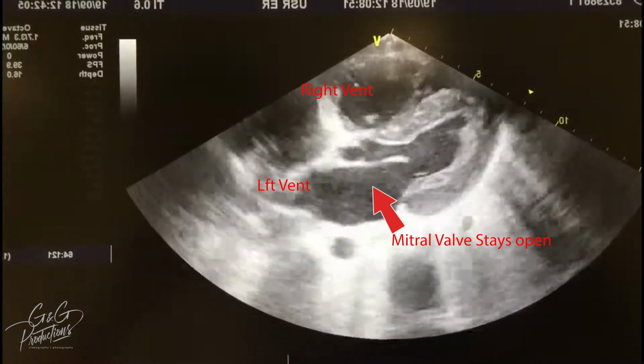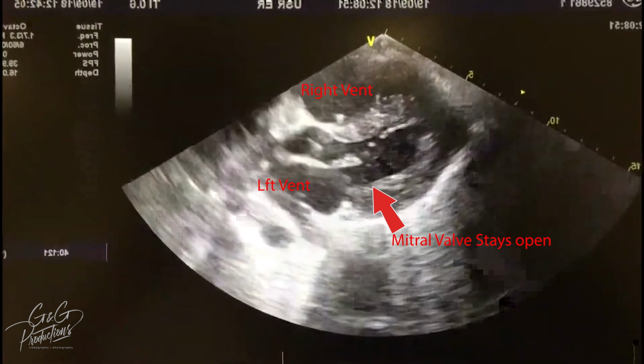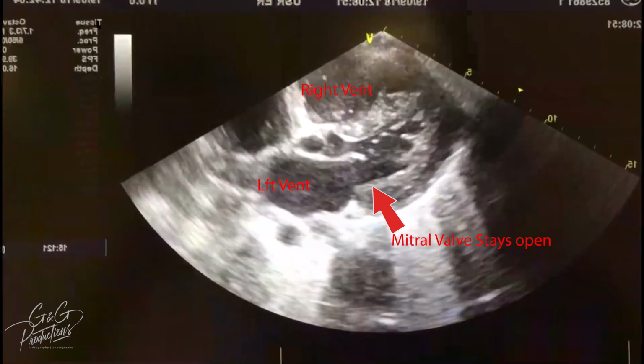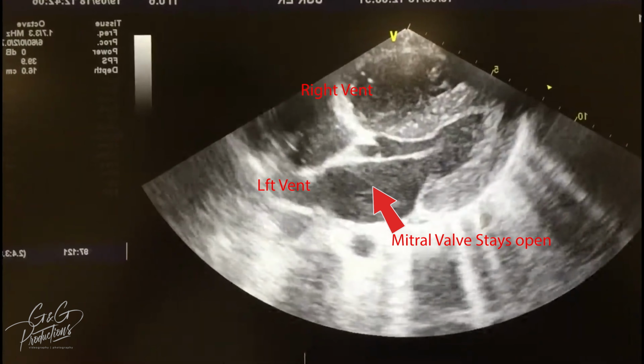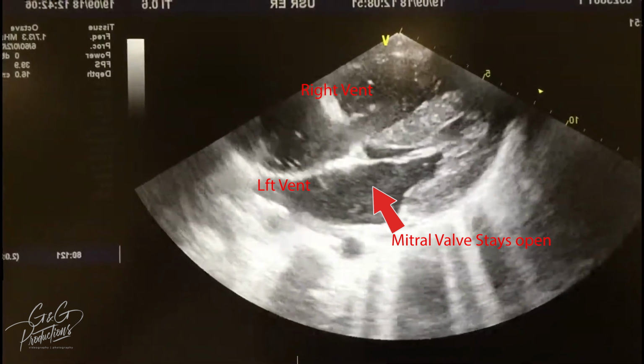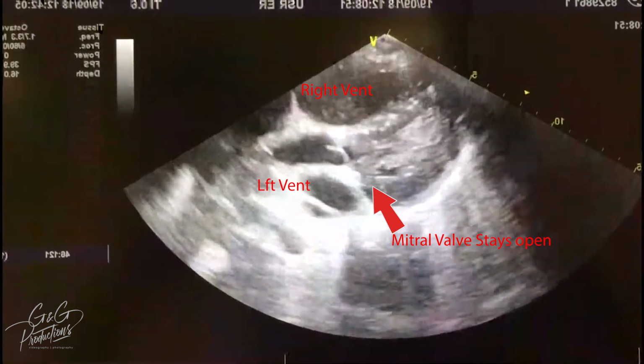Okay, in the third video here, it is a true PEA. It's showing electrical impulses on the monitor, but you can see the right ventricle and the left ventricle not filling up with blood, and the mitral valve over where the arrow is just staying continuously open. And along the floor of the heart, the bottom of the heart, there's no organized pumping or anything like that. This is, in essence, a true PEA.